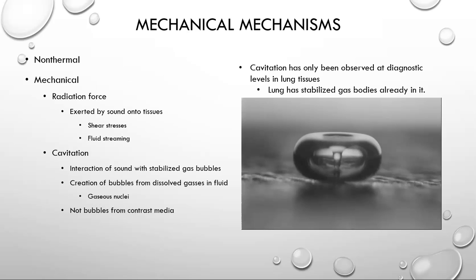Beyond thermal effects, we have mechanical mechanisms. These are known as non-thermal, or more specifically, mechanical, if you're taking a test. And these work by radiation force. This is the force exerted into the tissues by the sound. Radiation force results in shear stresses and fluid streaming. Cavitation is another mechanical mechanism that occurs when there's an interaction of sound with a stabilized gas bubble.